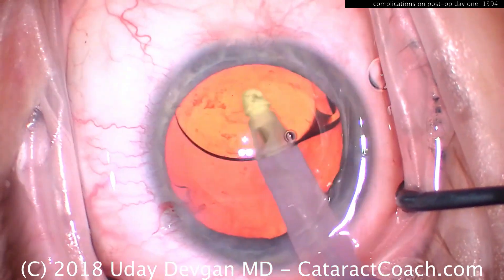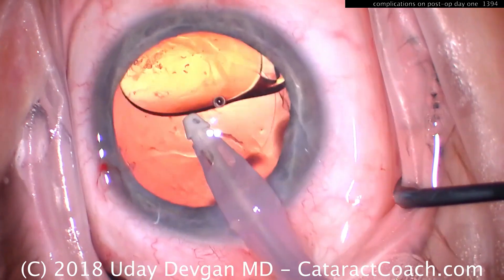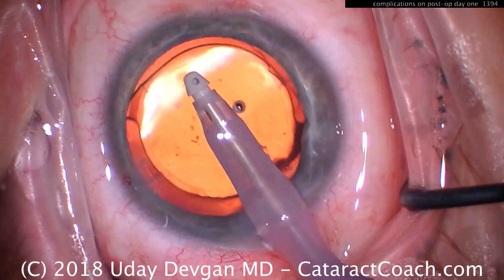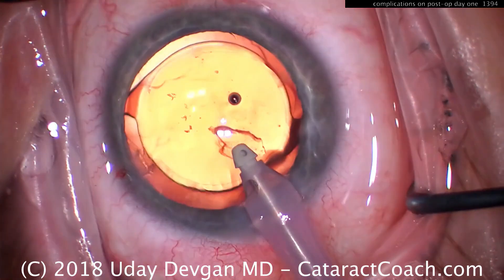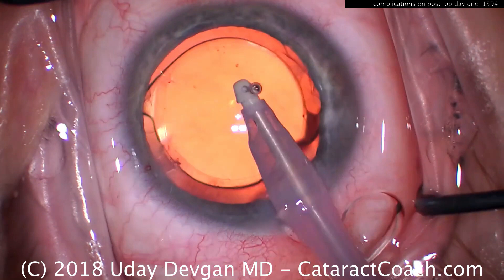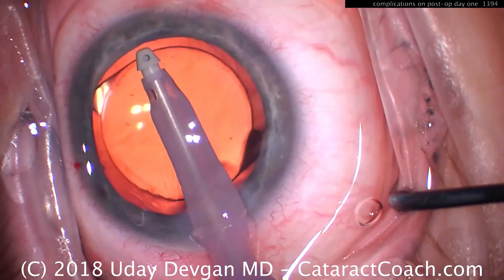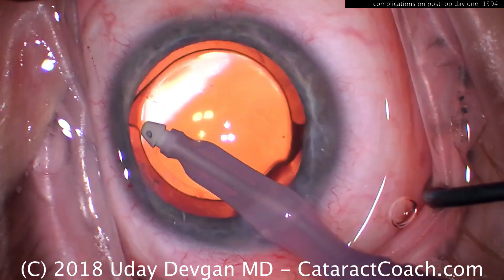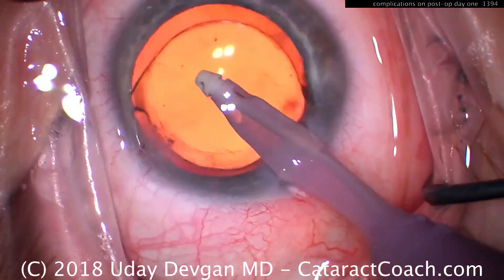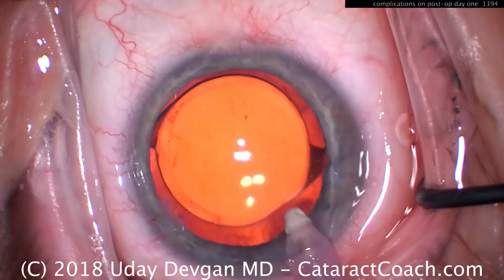At the end of the case, we've got mostly cohesive viscoelastic filling the bag. Go in under the IOL optic, removing that viscoelastic using high vacuum and high flow — 500 millimeters of mercury vacuum, flow of 50 or 60 cc's per minute — to really crank through and get out all the viscoelastic. It looks pretty clean. Notice how we're going around the eye, towards the angle on top, going 360 degrees.